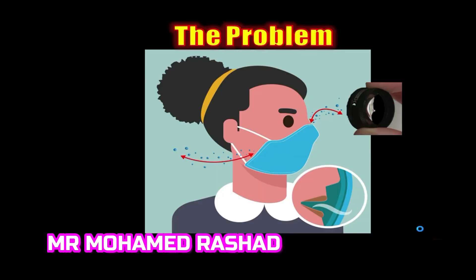Why does the lens become foggy? This is because the mask is not fitted well on the face of the patient. There is a gap between the face and the mask, and this gap leads to air escaping from under the mask and causing this fogging.